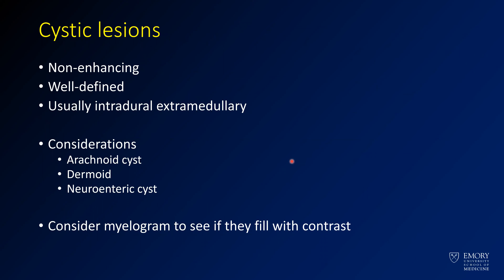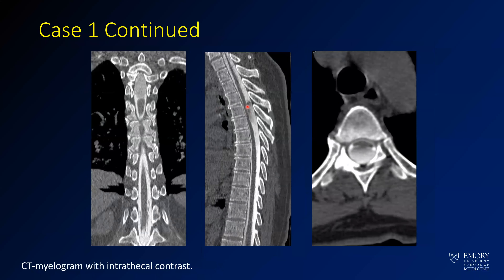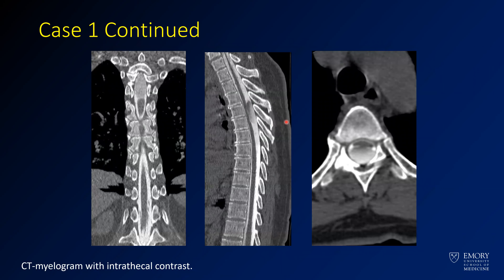A brief description of some cystic lesions: sometimes you can have things that don't enhance. Most of the time these are intradural and extramedullary. You can do myelograms to see if they fill with contrast. Here the cord is compressed anteriorly, very bright on T2. On myelogram, a little lesion is outlined, filling with contrast slightly — this is what an arachnoid cyst can look like: very T2 bright, causing cord deflection, very hard on MR to differentiate from an adhesion. They tend to be CSF intensity on all sequences, can cause bone remodeling, and can fill on myelogram.